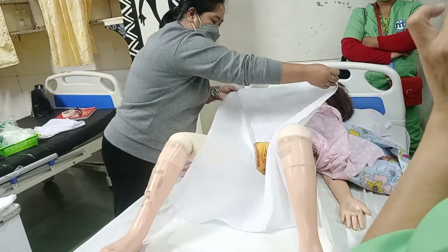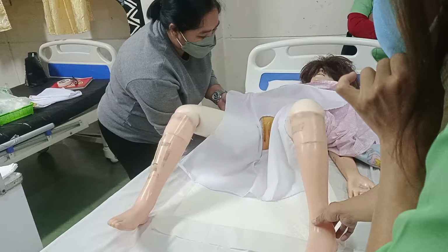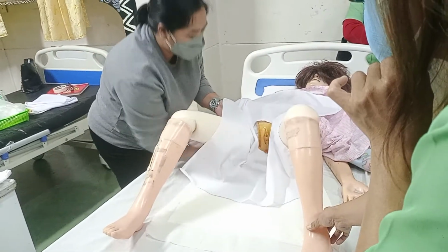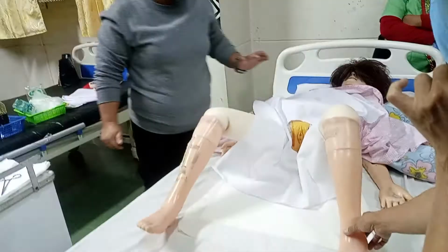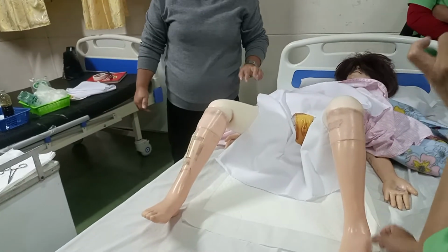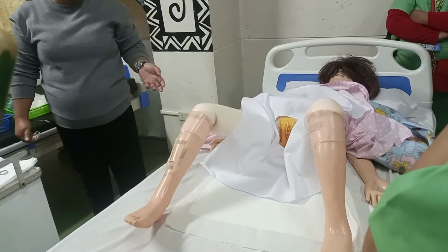Afterwards, ilagay natin siya doon sa may perineal area ni ma'am. Okay? As much as possible, dito lang kayo sa loob, humawak. Okay? Doon tayo sa sides. That is to provide a degree of privacy. Hindi mo naman kailangang tingnan ng puwet niya kung ikaw ay magka-catheterization.